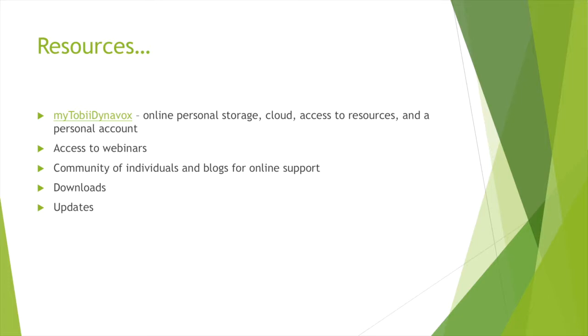Some resources that Tobii Dynavox offers. If you click the link in the presentation itself, My Tobii Dynavox, it'll bring you to the Dynavox website. There is your online personal storage. It also offers the personal cloud where you can back up your device or devices and have access to them at any time or anywhere. It gives you access to resources, and it's your own personal account.